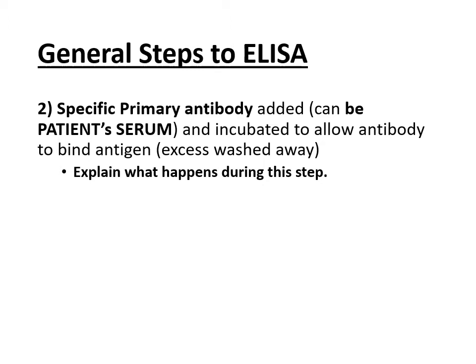So now here is the important concept, the real core concept that you have to understand for ELISA. When you do this step, when you add your patient sample into those wells, there are two possibilities. If your patient is currently infected with, let's use today's example, HIV, then what has their body started to do?